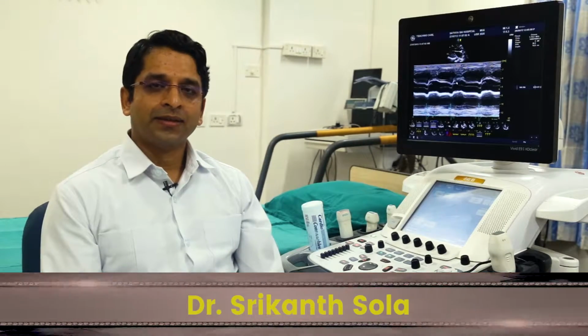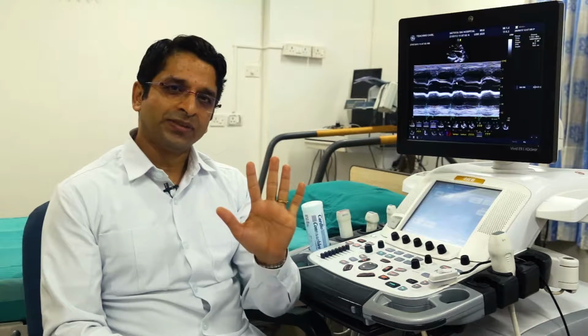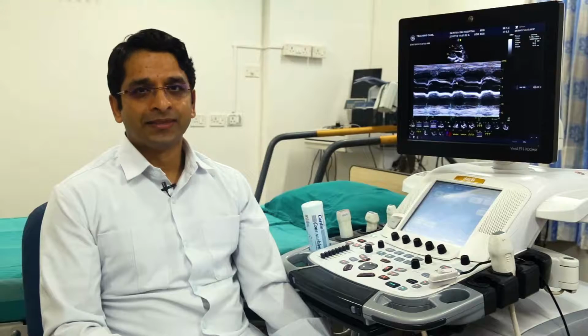Hypertrophic cardiomyopathy. It's a not uncommon disorder that we see in our echo labs. Today, let's go over the 5 things you need to do to get a better echo in these patients.